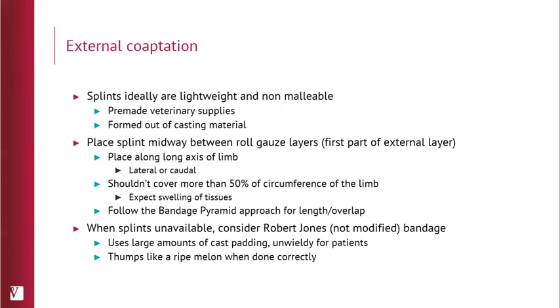Similar to the pyramid that we use for displacing regular bandage material, if we are placing a splint, we also want to make sure that the splint does not go substantially over either edge of the inner layers of the bandage, because we can have that splint then rub on the skin itself. And depending on how that last layer of bandage is placed with a splint in there, that could potentially compress down and lead to a tourniquet effect again.